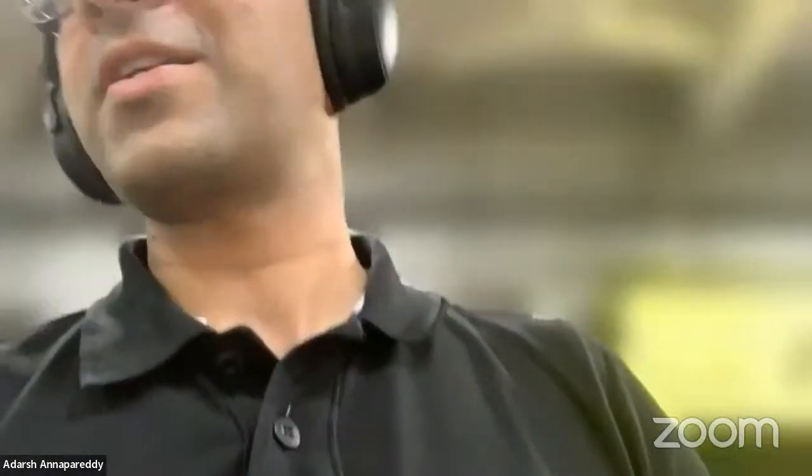No, what I'm saying is your rod cannot reach the fracture or negotiate. I'm not talking about that fracture. In general, we put a rod for osteoporosis patients. Yeah, but here the top plate screw will come into the way of the tibial rod. Okay. So don't make it complicated. Regular knee, little plate, go home.